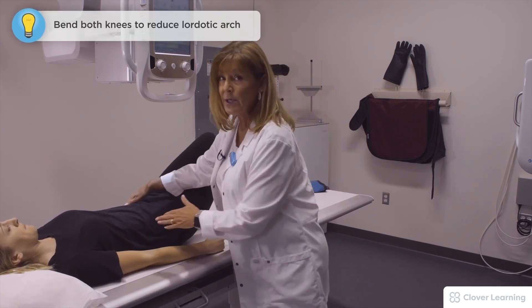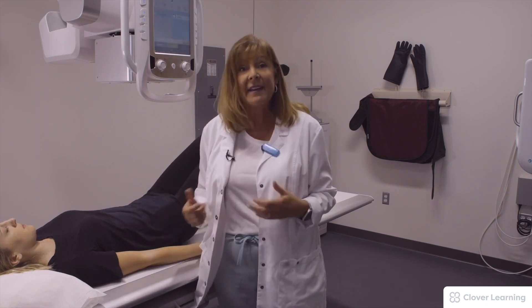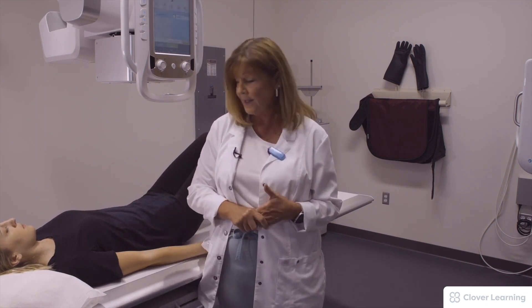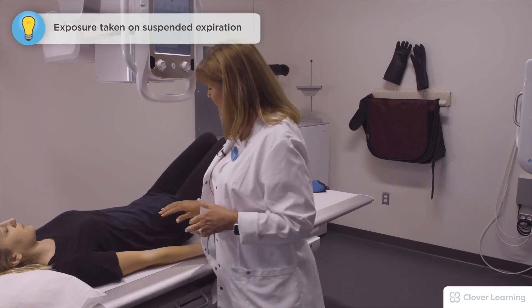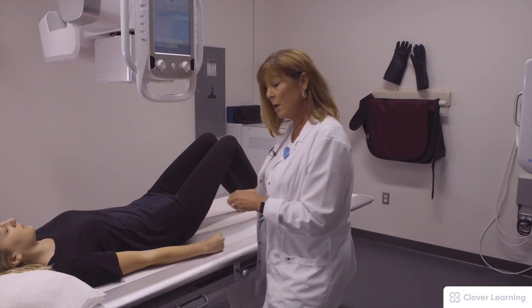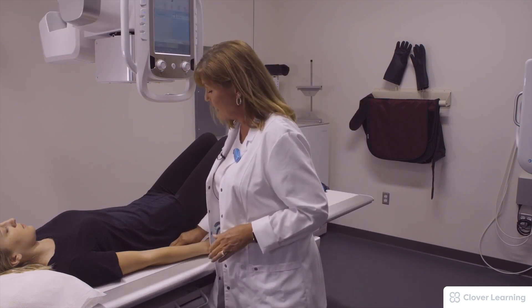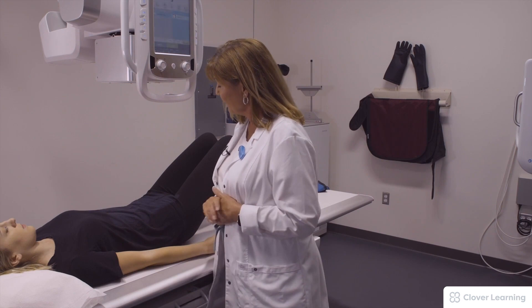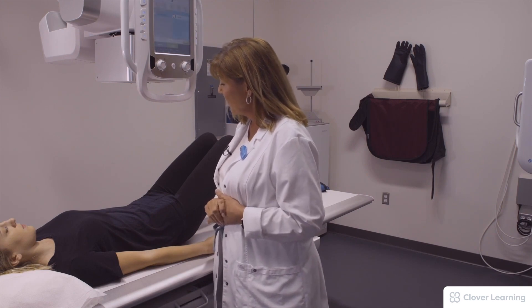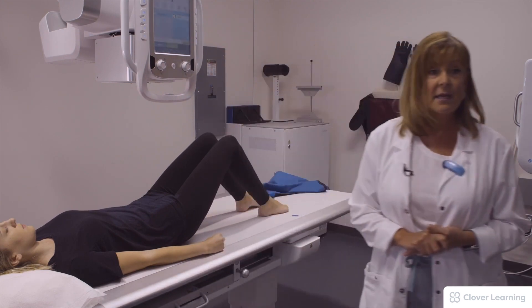We're going to have our patient bend her knees to reduce that lower lumbar arch. We are going to use a respiration of exhale and then hold their breath and suspend. We're going to use a right marker over here on the right side and the patient will hold very still and the exposure is made.